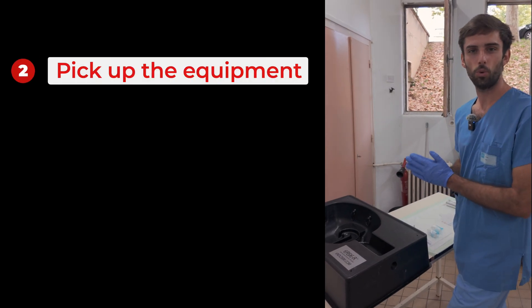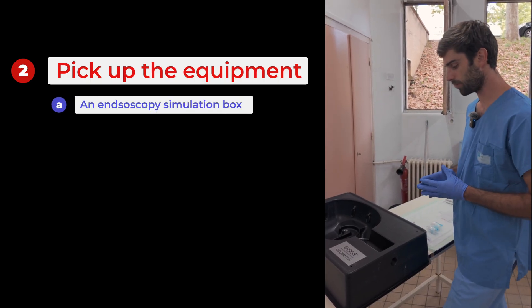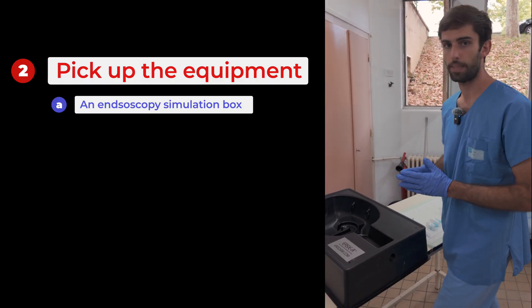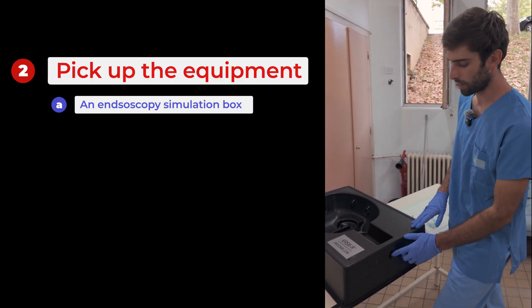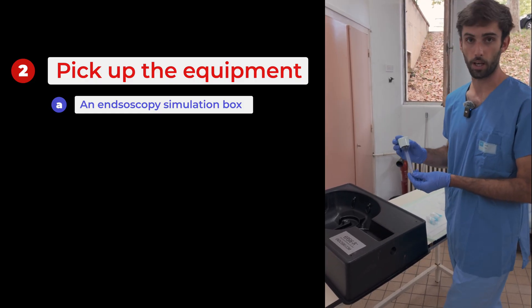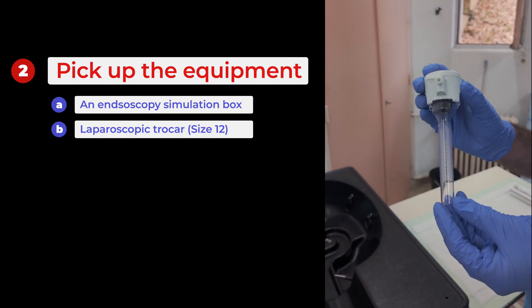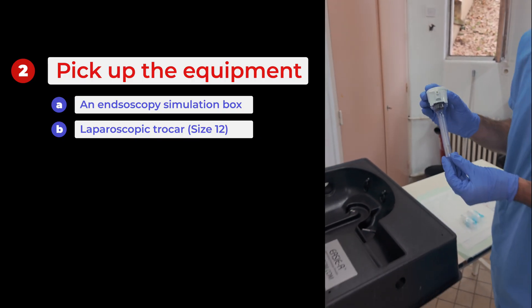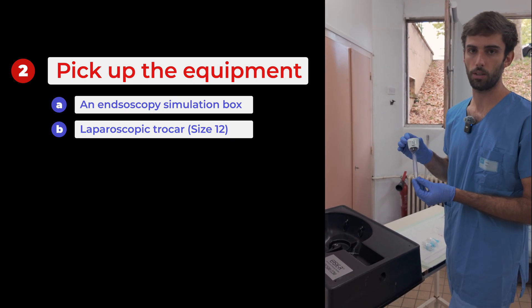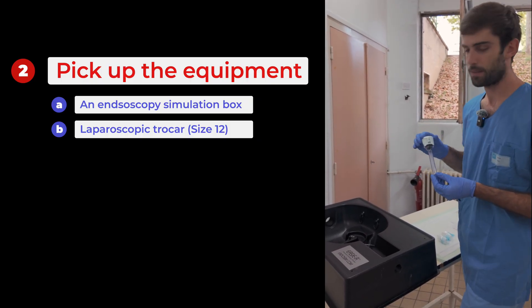Now I'm going to show you the equipment we need to set up a model. The first and most basic thing is an endoscopy simulation box. There are different brands and different shapes — we don't have any particular preference. The main thing is that it can accommodate a cow's colon and that there is an opening to insert the endoscope with a trocar. The second thing is the trocar — a laparoscopic trocar. The most important thing is the size; it must match the endoscope you are using. We found that the optimal size for our gastroscope was size 12, which was wide enough for the endoscope to slide through easily and at the same time was completely airtight.